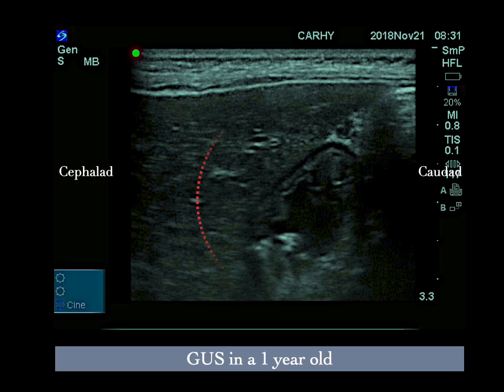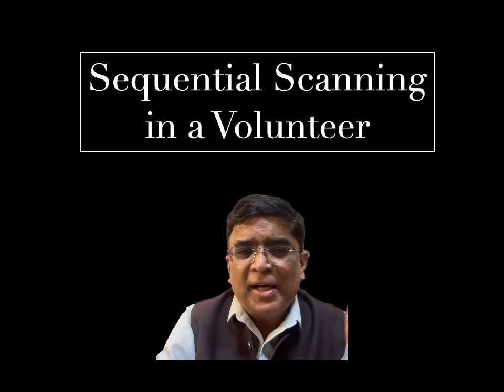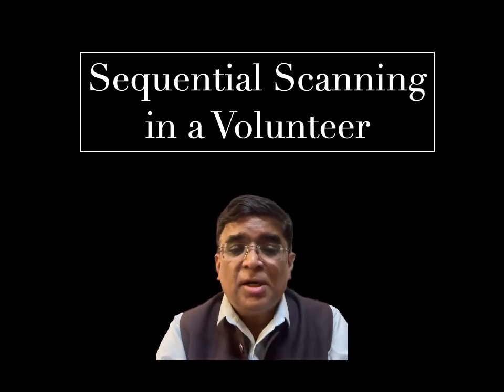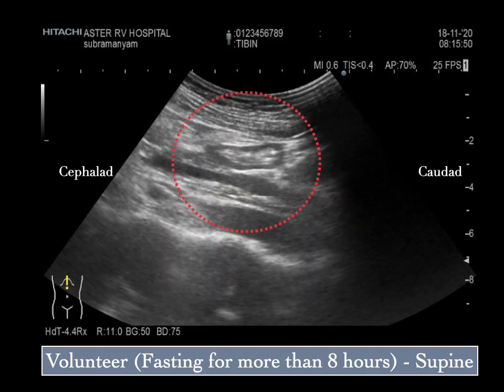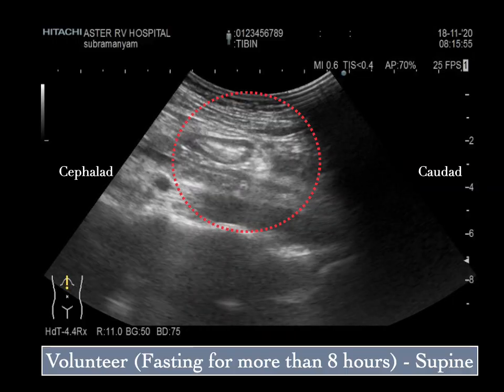Now this is the appearance of the stomach in a 1-year-old child, where you can appreciate all the 5 layers of the pyloric antrum. Now this is another sequence of images. I am sure you will appreciate it. I had asked one of my colleagues to come with an empty stomach, and we scanned sequentially to see how it looks. This is the image when a volunteer had come fasting for more than 8 hours. You can identify the pyloric antrum there.